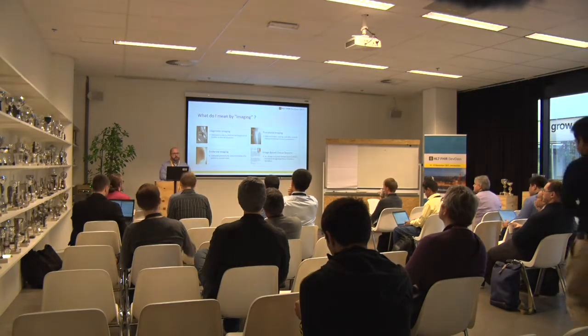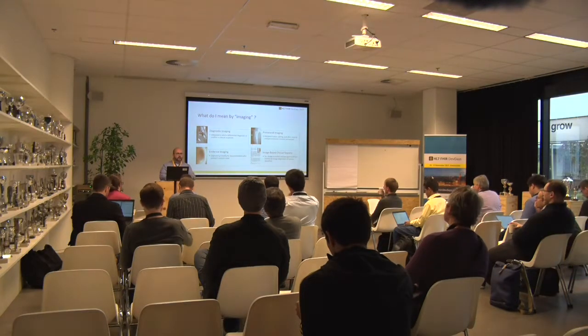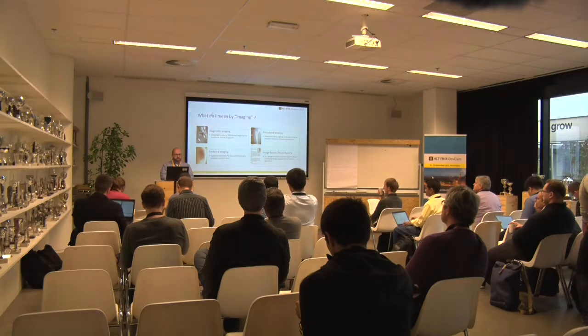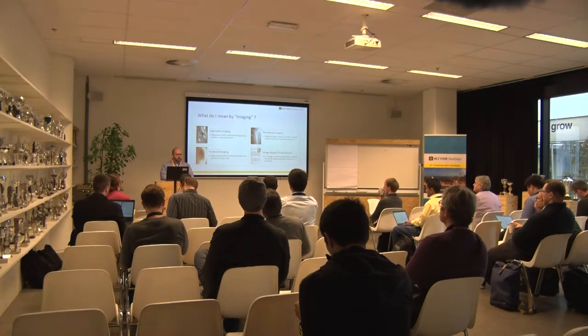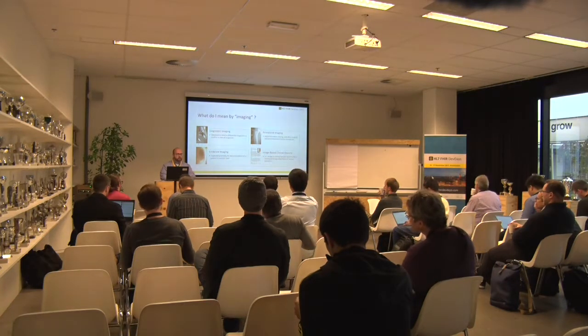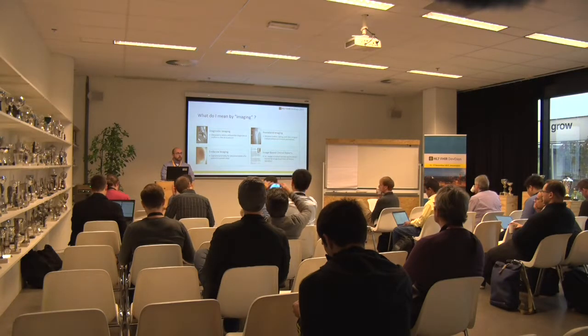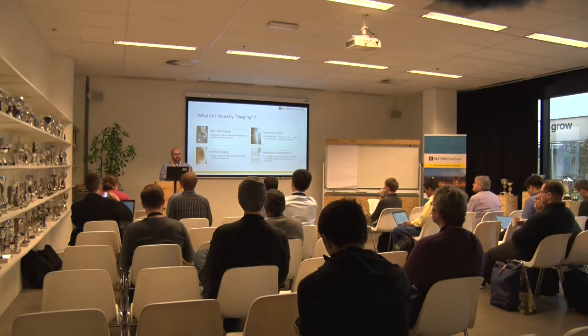So when I talk about imaging, I'm talking about diagnostic imaging, the classical radiology, where I have an X-ray, I have CTs or MRIs, but I'm also talking about evidence imaging, where we capture it for the documentation of the patient's current state, like if they've got a wound you want to take a picture of, as well as procedural imaging or point of care. So typically here it would be ultrasounds in the emergency department, where we would be capturing this imaging. We might not necessarily be reporting on that, but we still need it as part of a procedure. And we want to take these images and image-enable clinical reports with it.